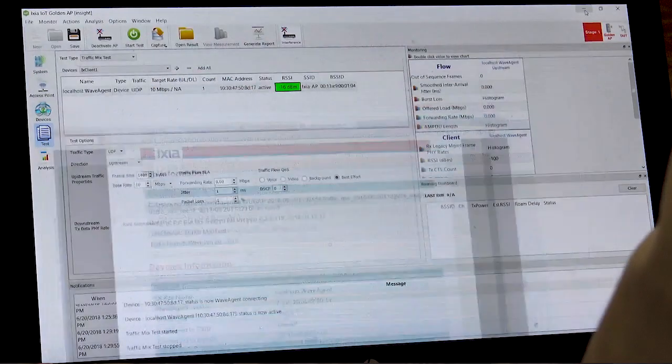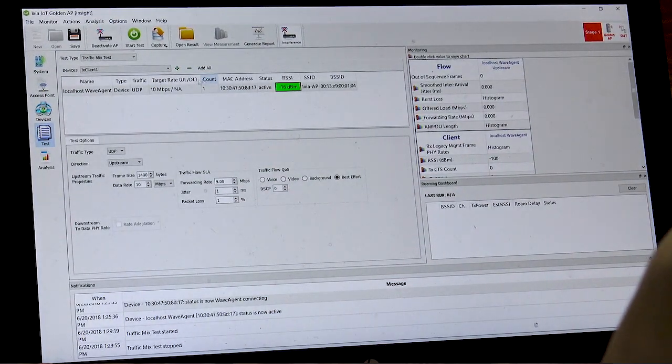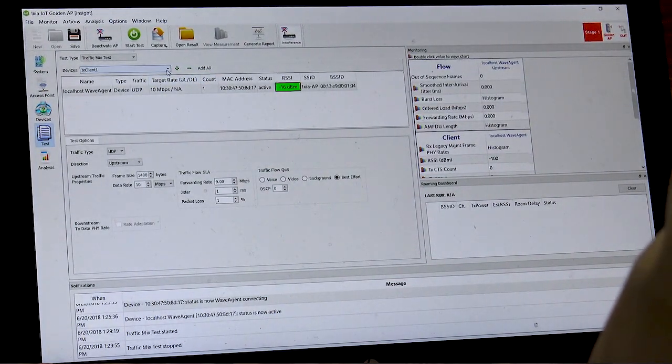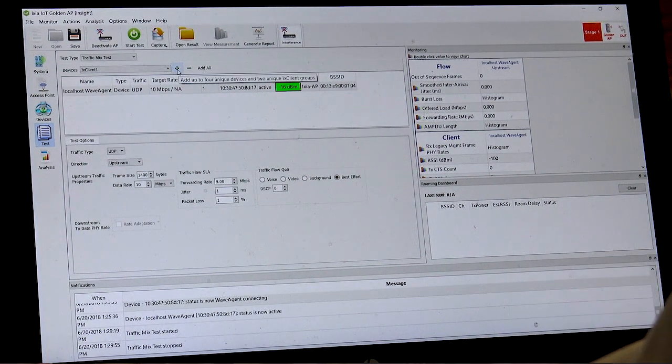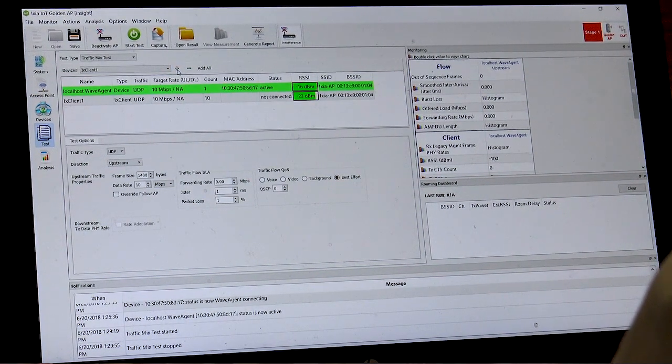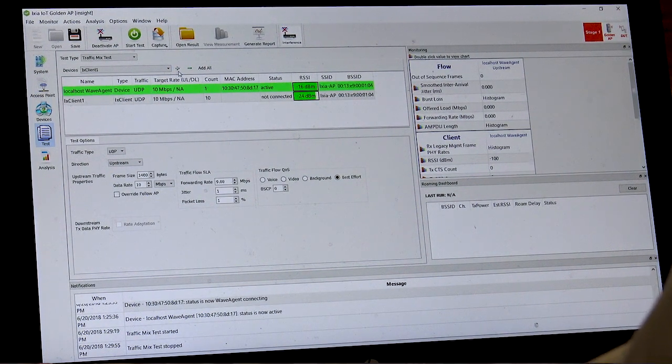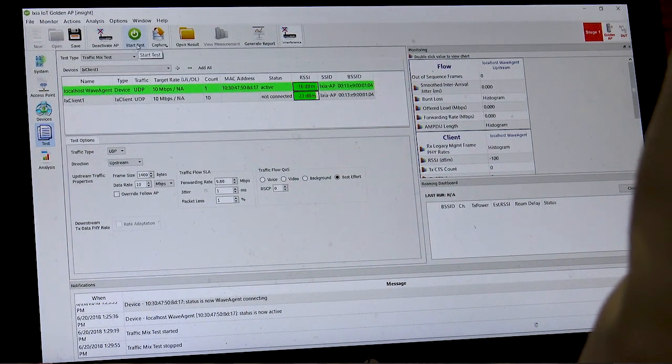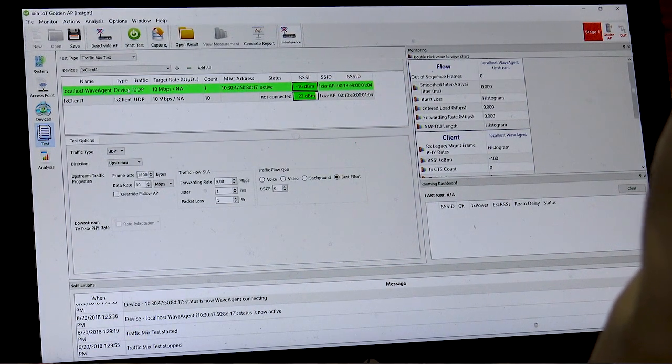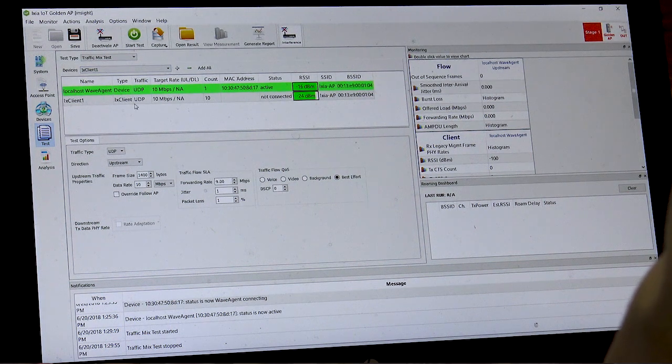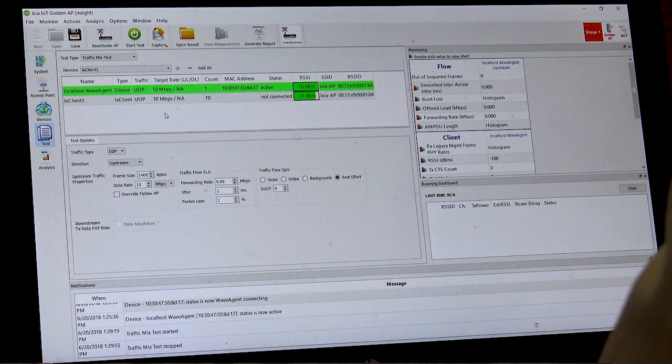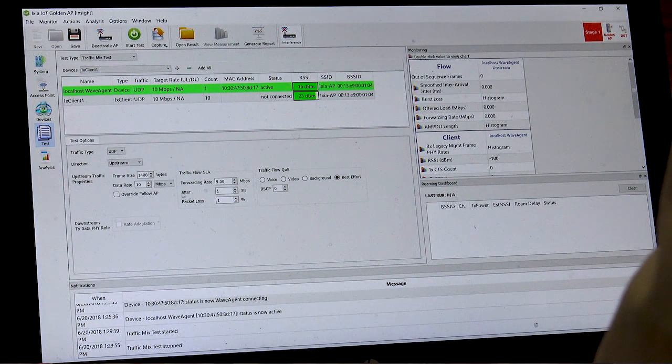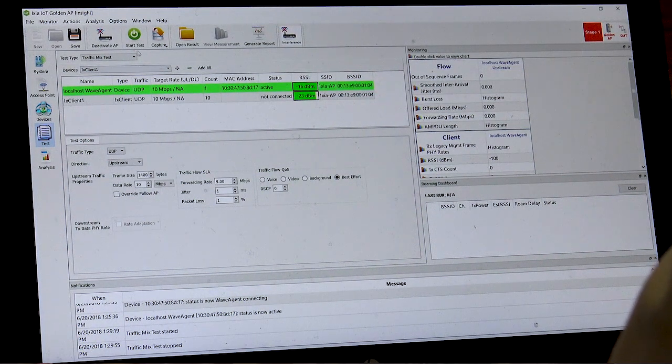Now in this next test, we'll add on 10 competing devices. This would simulate what the device would experience if it were in a hospital environment. To add the devices, we just simply choose IX clients, which is the simulated clients, and then they'll also run the traffic at the same time.